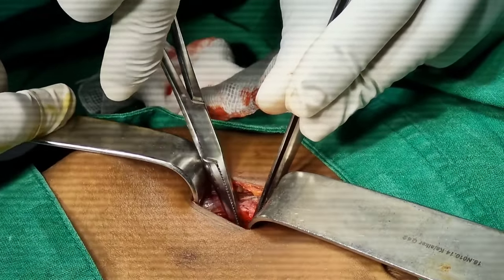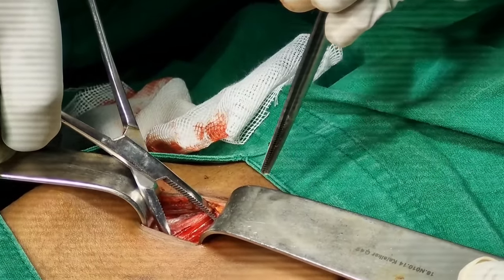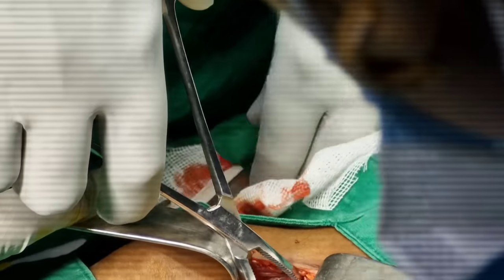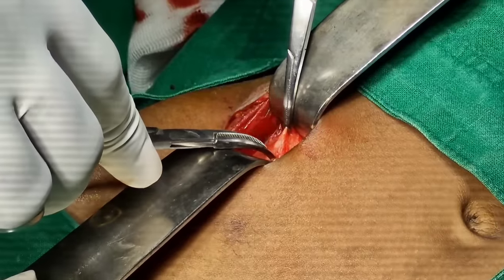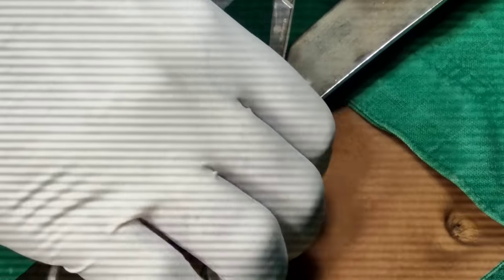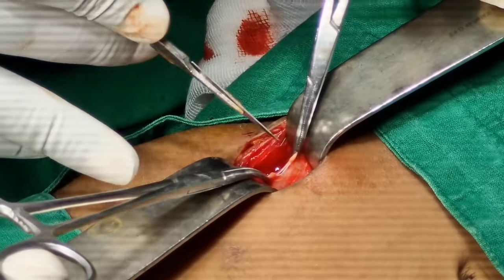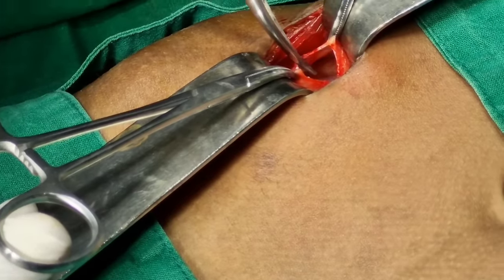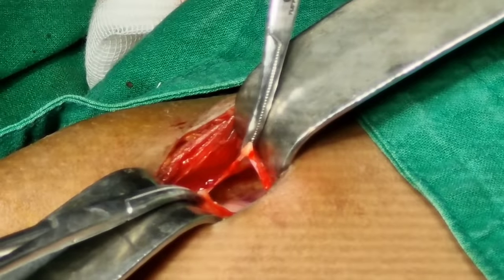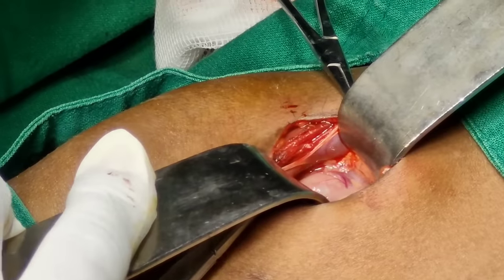Care must be taken not to go deep. If not, you will blindly open the peritoneum and bowel injury might be possible. After that, hold the peritoneum with two artery forceps and lift it up. Palpate it with a finger for any abdominal content. After confirmation, cut it using a blade then use scissors to extend the incision. Use a shearing motion of the scissor, not cutting. Now you can see the abdominal content.